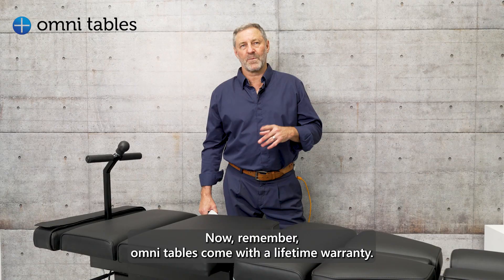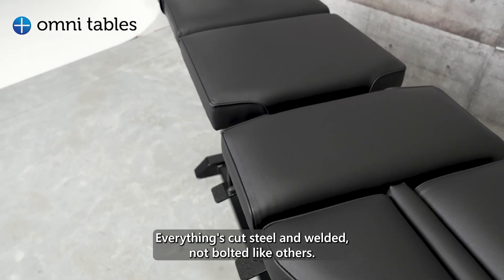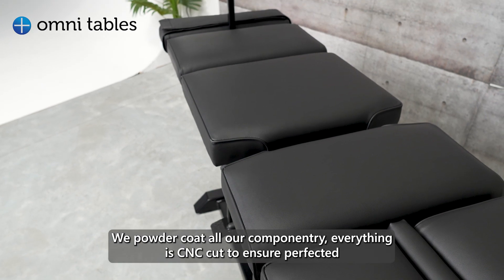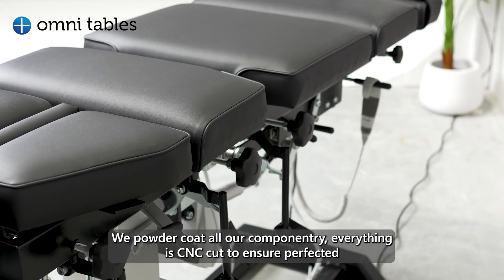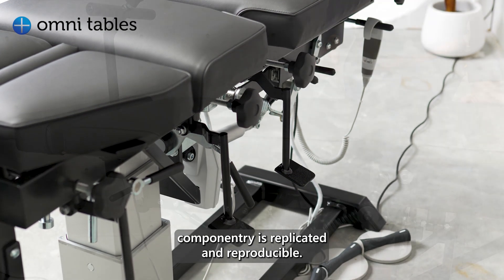Remember, Omni Tables come with a lifetime warranty. Everything is cut steel and welded — not bolted like others. We powder coat all our componentry, everything CNC cut to ensure perfected componentry — this is replicated and reproducible.